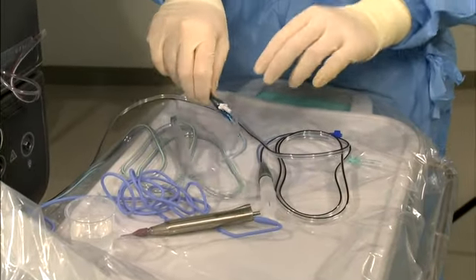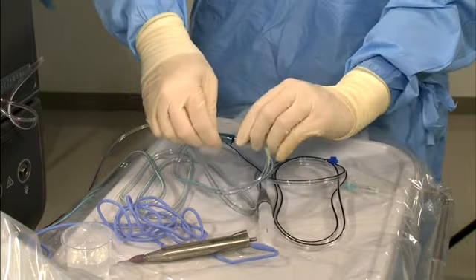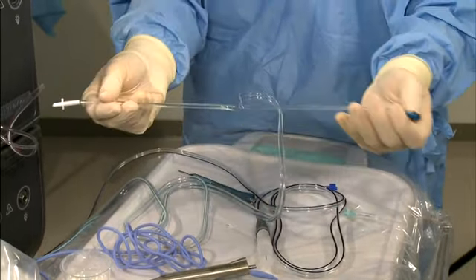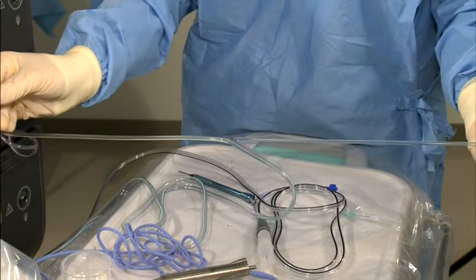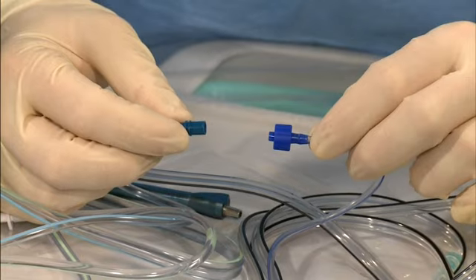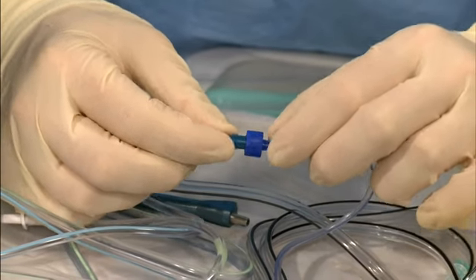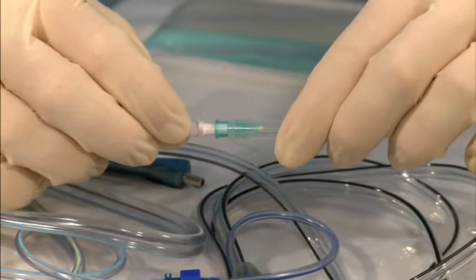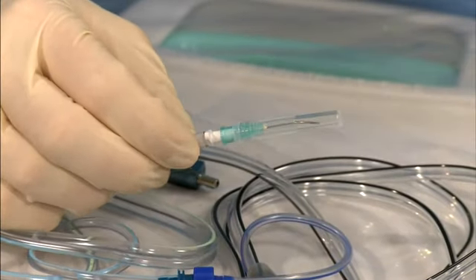Disconnect the irrigation and aspiration tubing connectors from the handpiece in use. Split the irrigation and aspiration lines for easier bimanual use. Connect the anterior vitrectomy probe's blue line connector to the blue aspiration line. Connect the white connector of the irrigation line to the irrigation cannula.